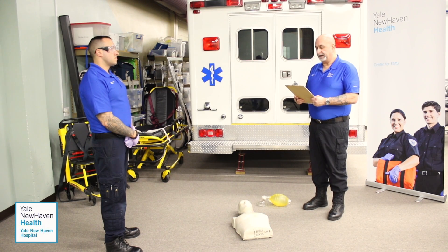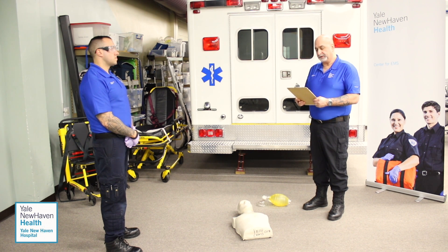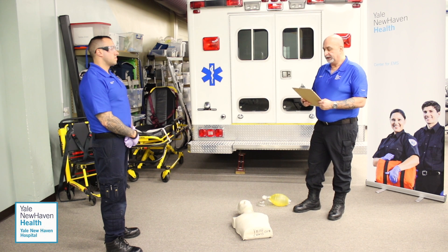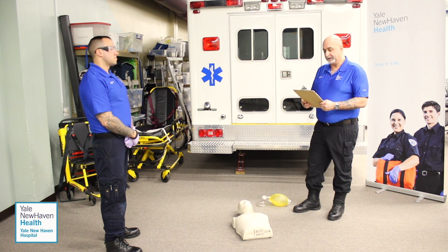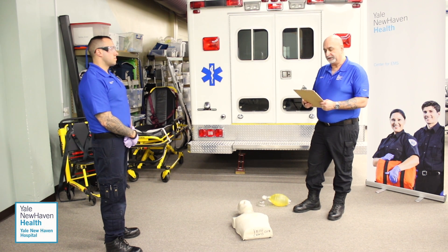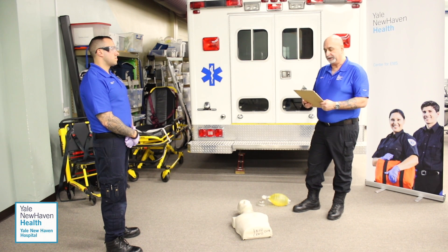This skill is designed to evaluate your ability to manage an out-of-hospital cardiac arrest by integrating patient assessment management skills, CPR skills, and usage of an AED. You arrive at this scene by yourself and there are no bystanders present. You must begin resuscitation of the patient in accordance with the current American Heart Association guidelines for CPR.